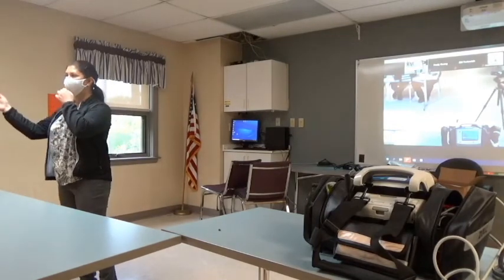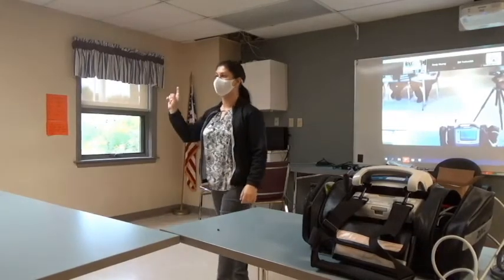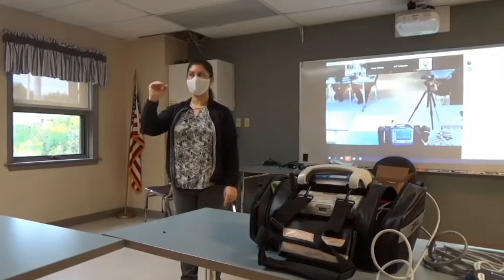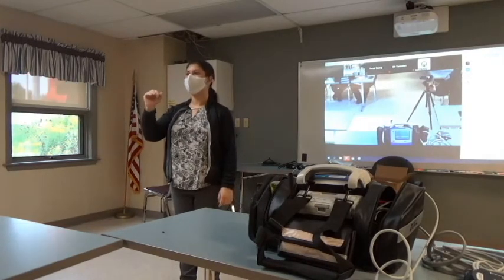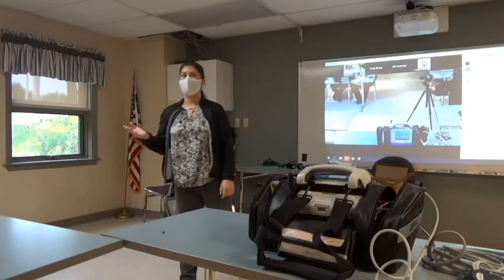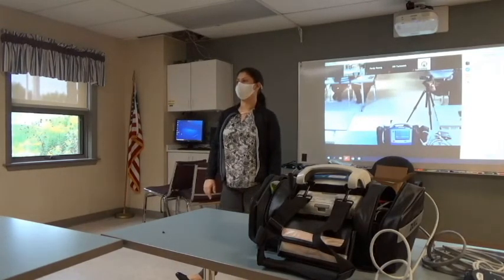It goes up by 10, down by 5. Always remember to start your pacer first and then adjust your milliamps. Everybody good? Okay. So we were just chatting about what happens if an electrode comes off of your patient, right?